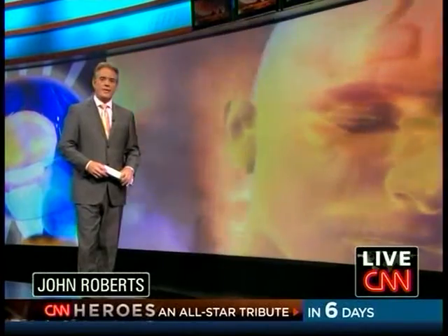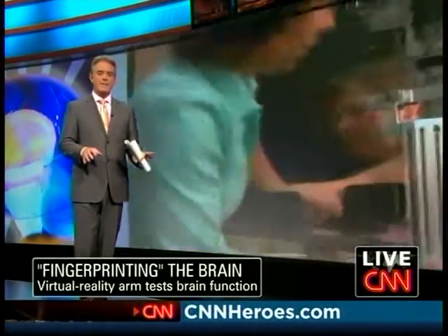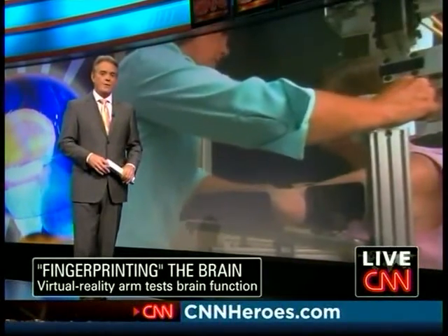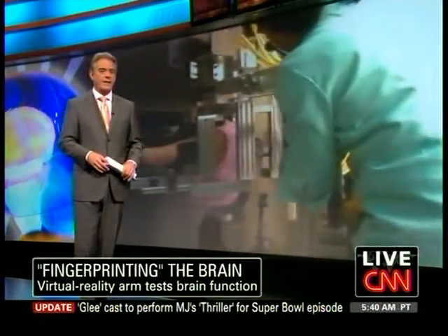Coming up in 19 minutes to the top of the hour, when someone suffers a brain injury, not all of the effects are necessarily obvious, even to some of the best trained doctors. That's where this next amazing machine comes in. The KINARM uses virtual reality and robotic arms to give doctors a look at brain function like they've never seen before.